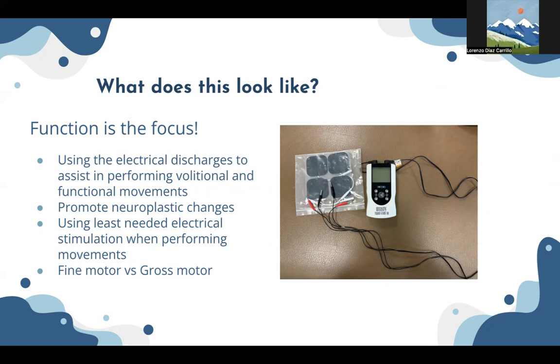So in this instance, you can do fine motor versus gross motor. Gross motor is a little bit easier depending on the pads that you have. Fine motor can be a little tricky when you're thinking about stimulating some of those muscles within the hands, like those intrinsic muscles.